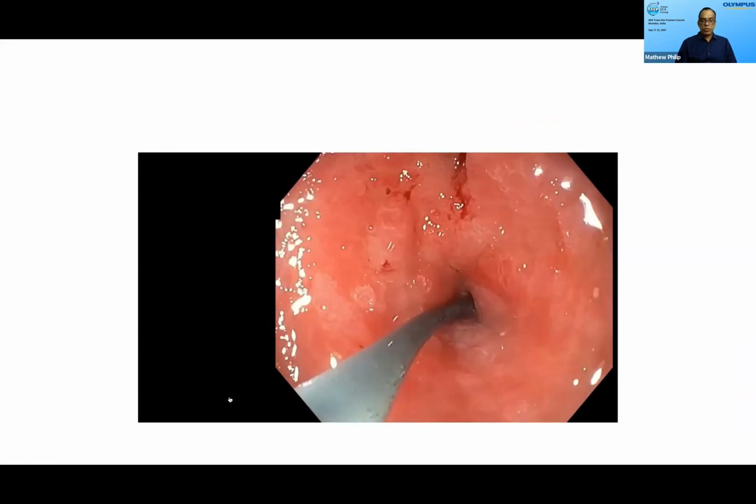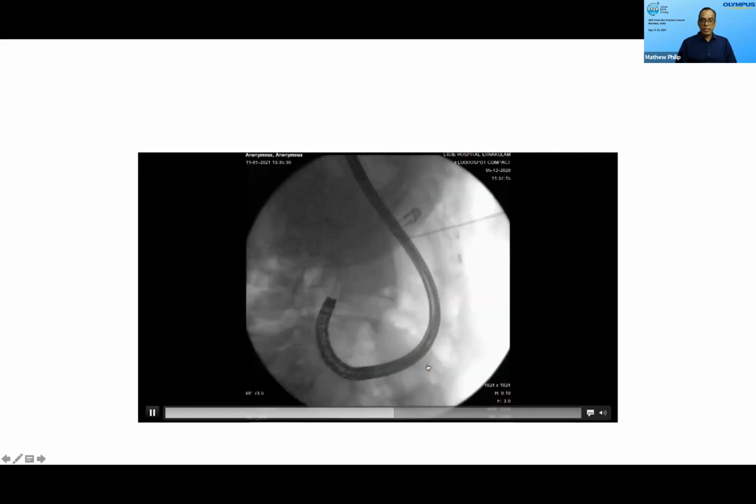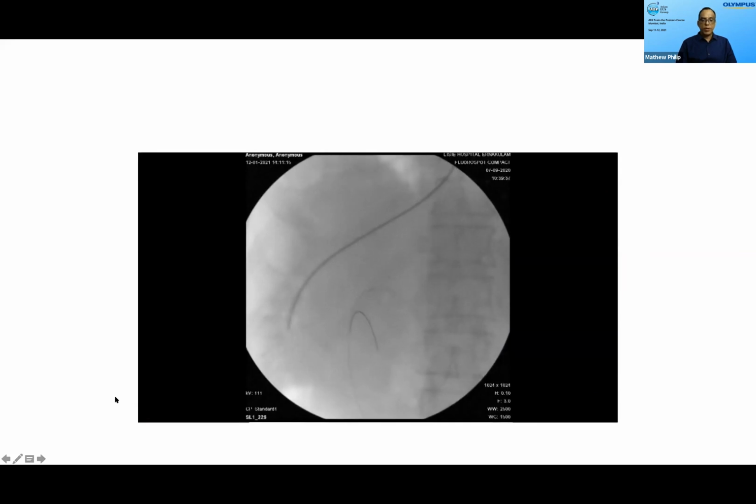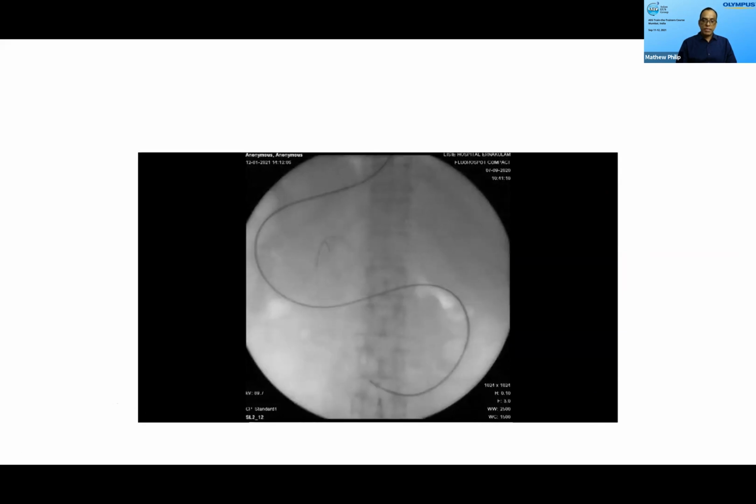It is always better to use it over a catheter so that the guide wire can be easily passed. Once it reaches there, over the guide wire, you pass your balloon catheter or tube and pass it beyond the DJ flexure, inflate the balloon and secure the position.